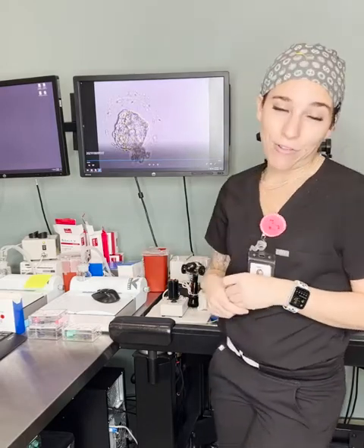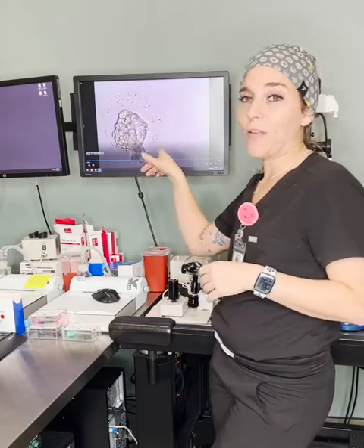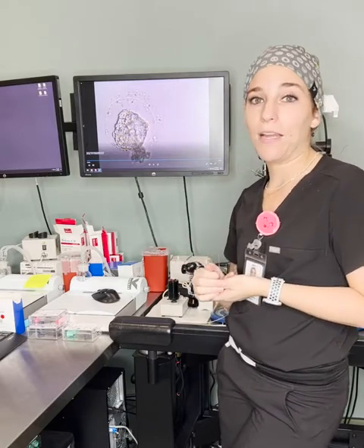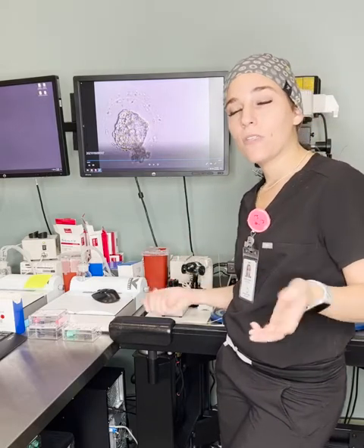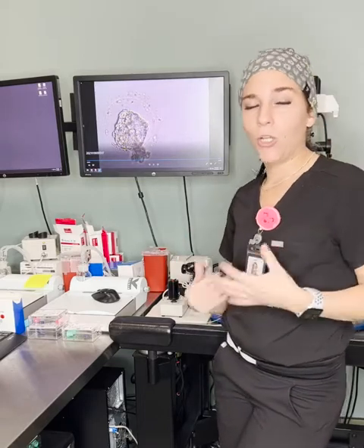Or the embryo didn't survive a thaw. So this one looks a little dark. It's not dead, but when an embryo is dead and shriveled up like this, completely black, usually an embryologist can tell right away at thawing time that the embryo didn't survive. We still give it some time to recover, but that re-expansion is something that you want to look for.